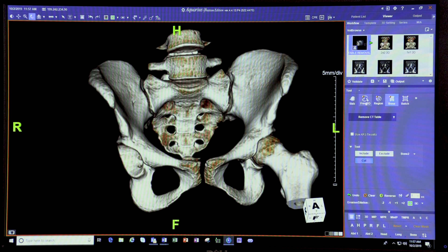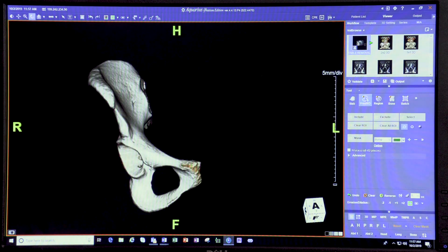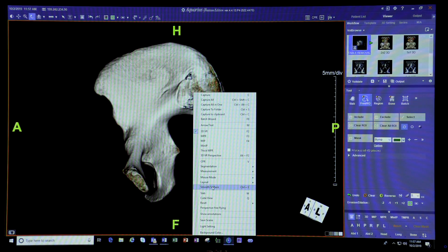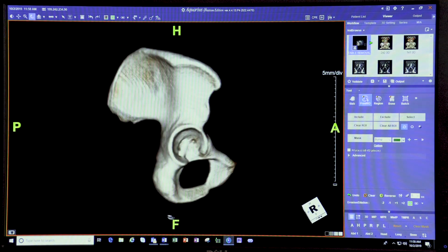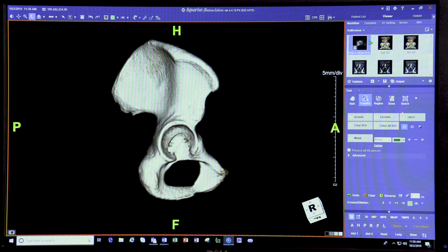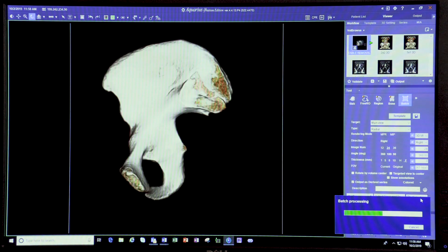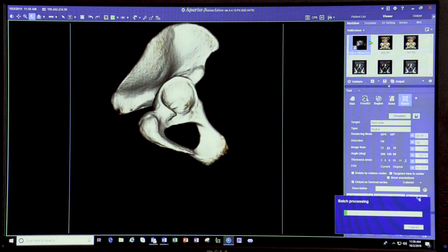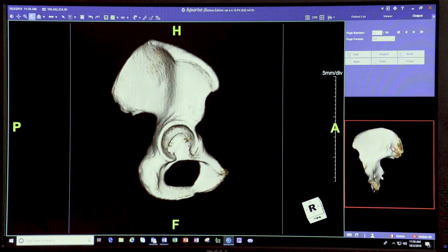If showing individual hips — as we do in our practice — you can use Free ROI again to cut through the area, since we don't need the full pelvis. Cut out the extraneous parts and any leftover bone pieces. Sometimes you get edgy artifacts; right-click and select Smooth Surface to fix that. Now we have the acetabulum. We show it from the side, go to Batch, start with right-to-left turn, then do up and down. You can see in your output panel you have the femur, then the acetabulum.